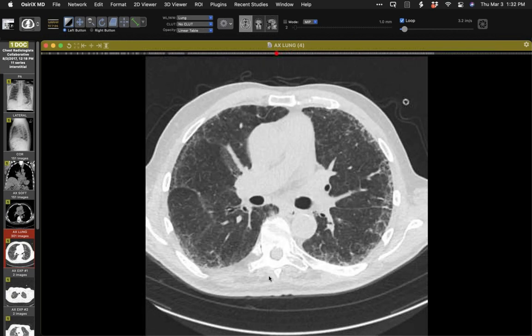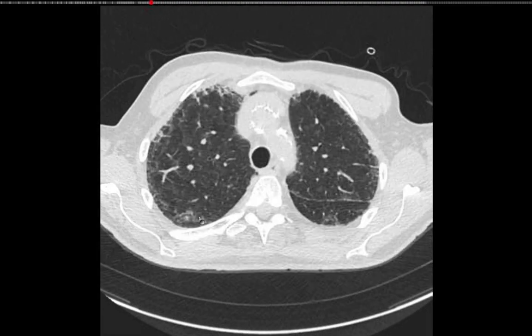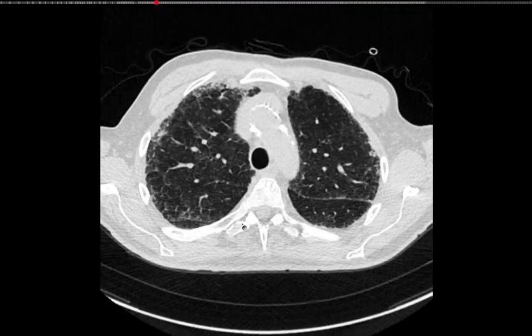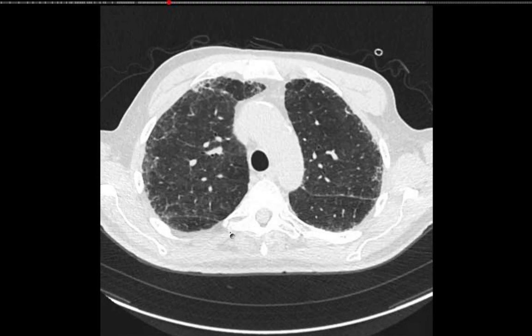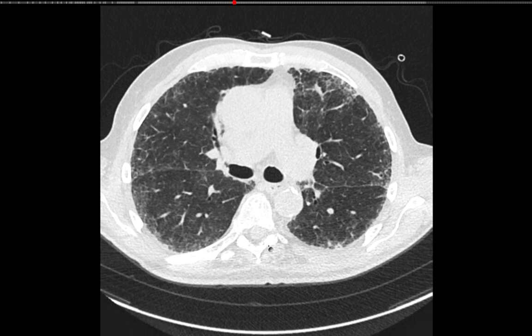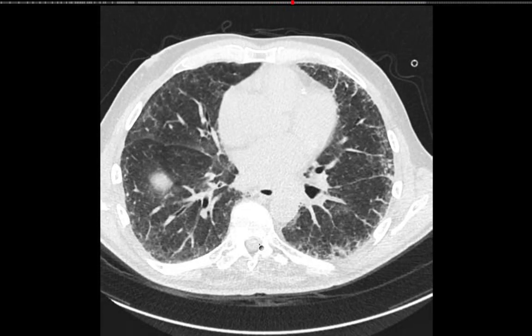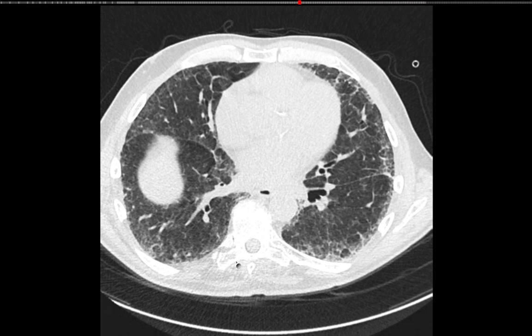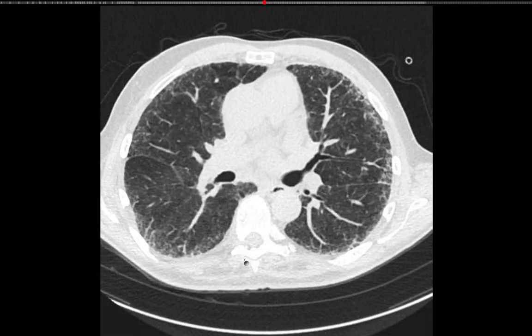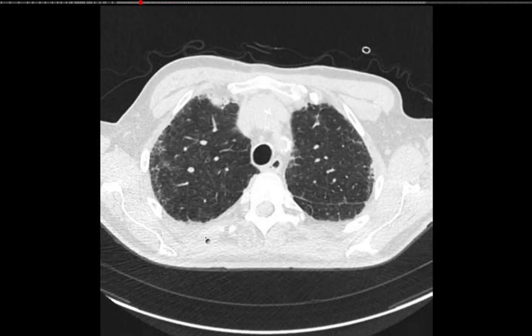I'm bothered by the density of the central lung. Unless there's some respiratory bronchiolitis superimposed — are they a smoker? Not that I know of. I'm seeing a lot of ground glass more centrally, and that bothers me. I don't see normal lungs centrally. Maybe two things going on. The indeterminate category is for cases that have features that don't necessarily suggest another diagnosis, but aren't close enough to just call UIP. There's too much ground glass, which technically makes it inconsistent, but the fibrosis is so subpleural that I like that component.